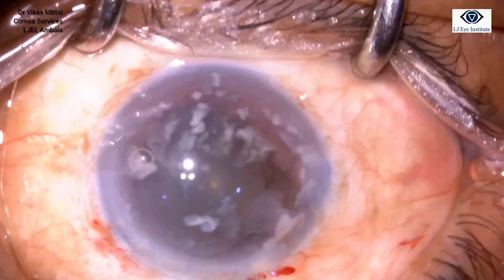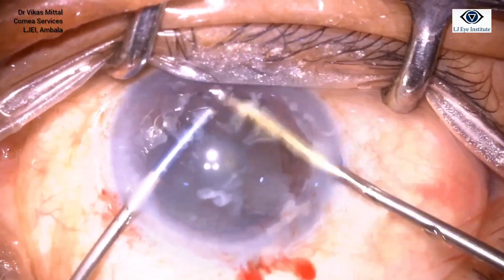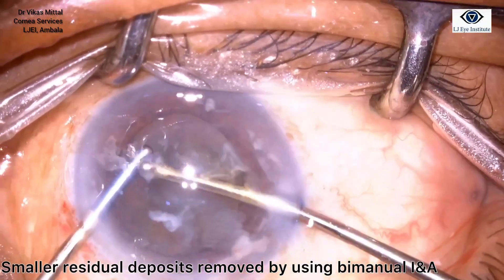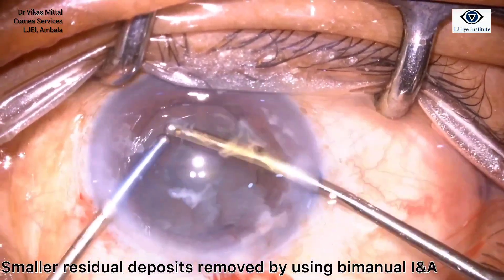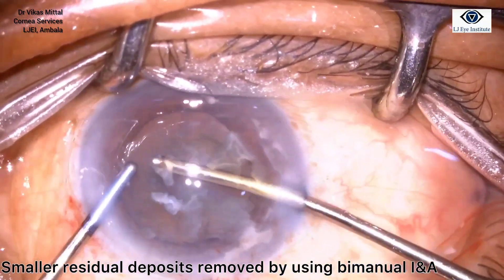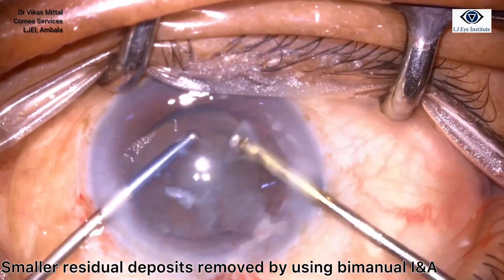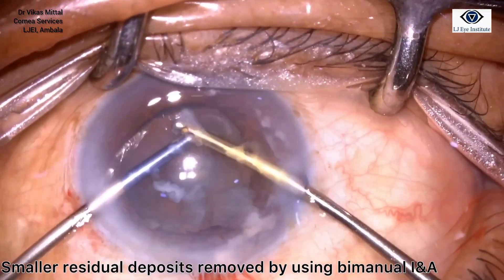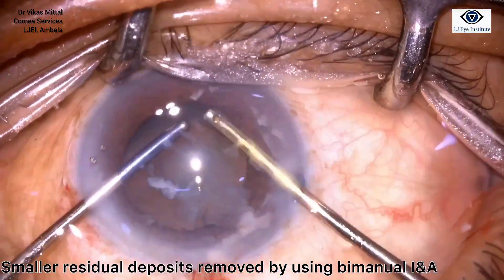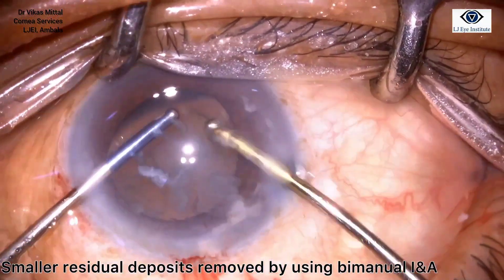We finally attempted removal with bimanual irrigation and aspiration cannula. The smaller residual deposits could be removed with this technique. We ensured to clear all the deposits adequately.